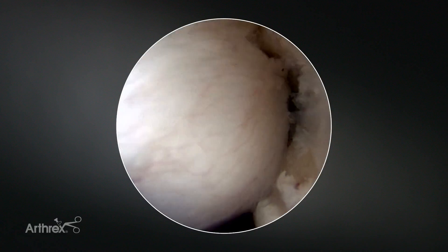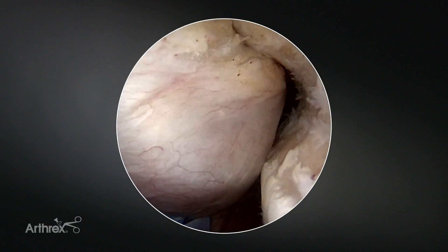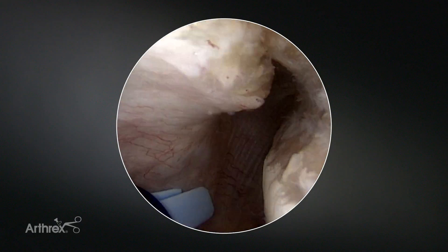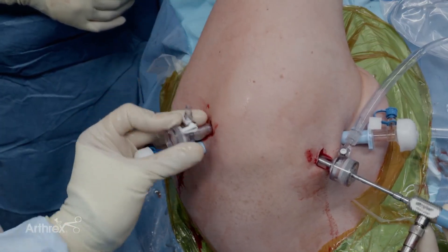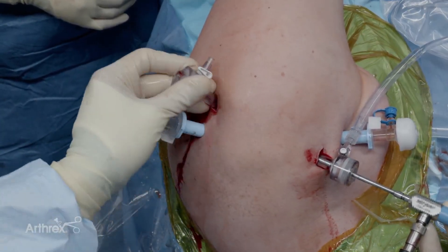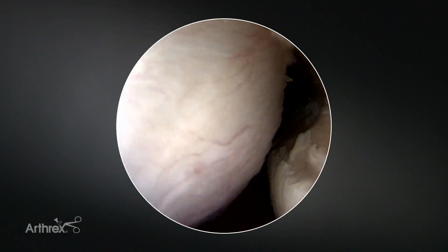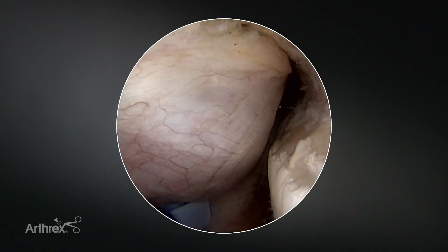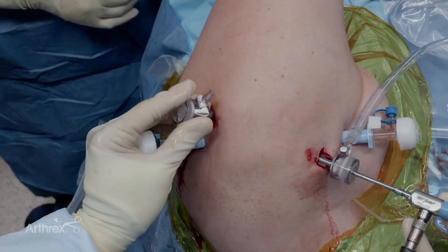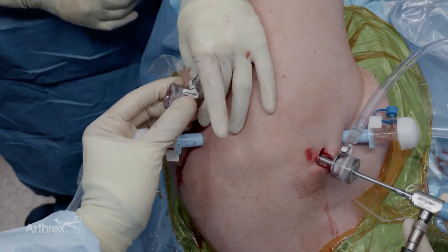The goal of the cannula is to go below the deltoid and just above the posterior soft tissue. At this point I take the cannula and move in a circular motion to clear out all the posterior soft tissue, which is the bursa. I can clearly see that I'm just above the posterior capsule and rotator cuff. Once we've established this space it's really important that your assistant holds the cannula so it does not back out.